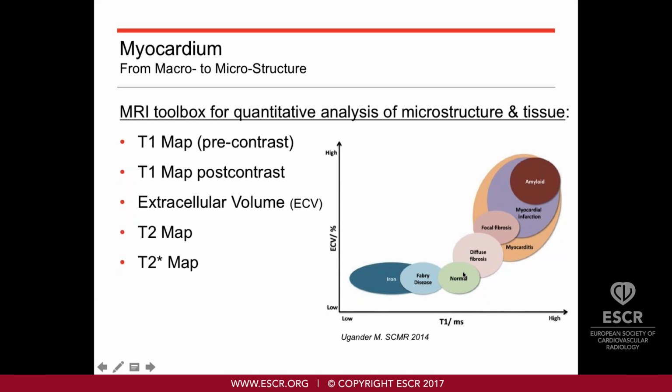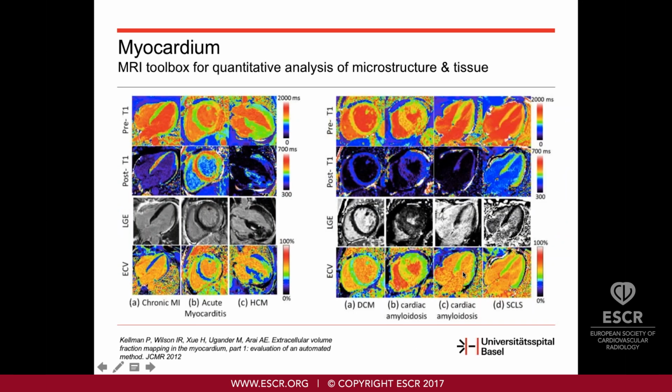A patient being treated by chemotherapy, and these drugs that the patient is receiving might trigger fibroblast activation and myocardial fibrosis. So MRI and tissue characterization might help us to identify myocardial fibrosis or undesired effects of chemotherapy to the heart at a very early stage.